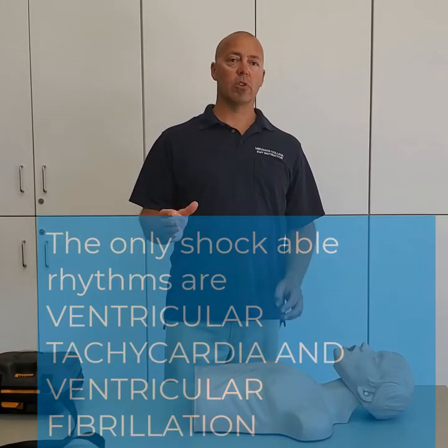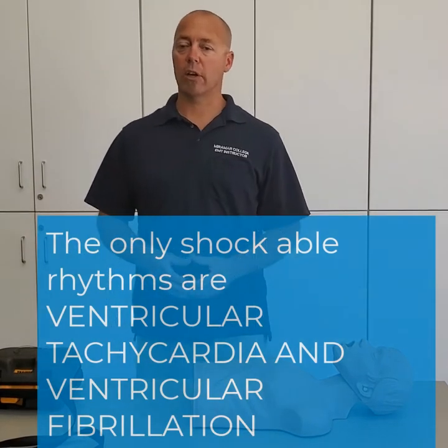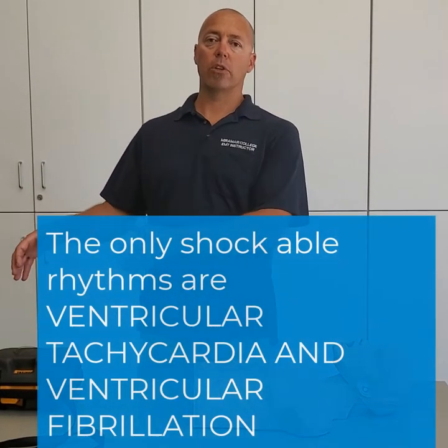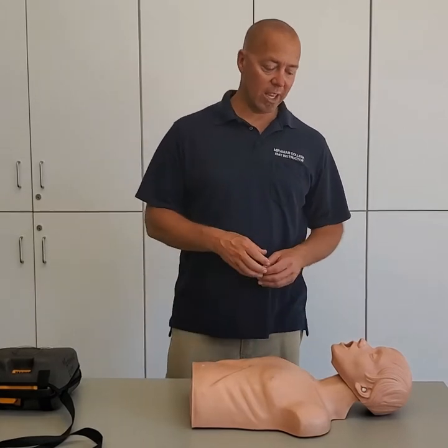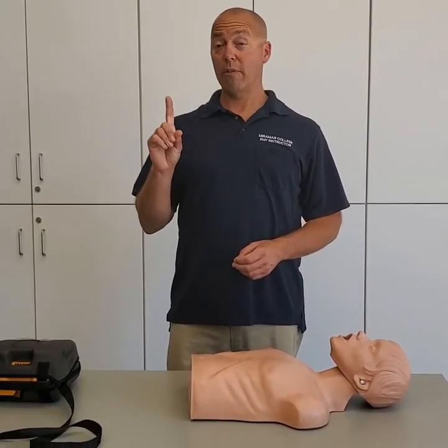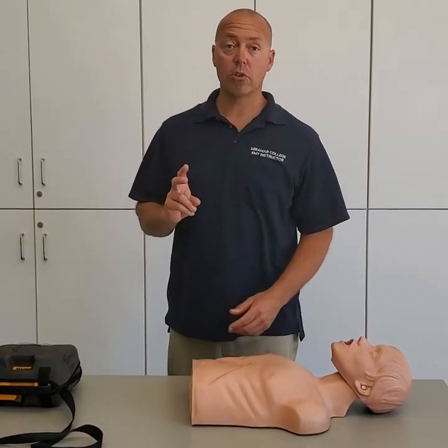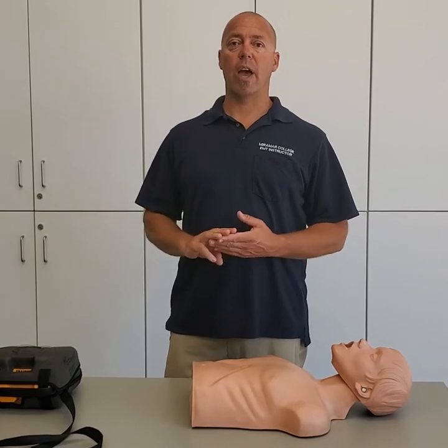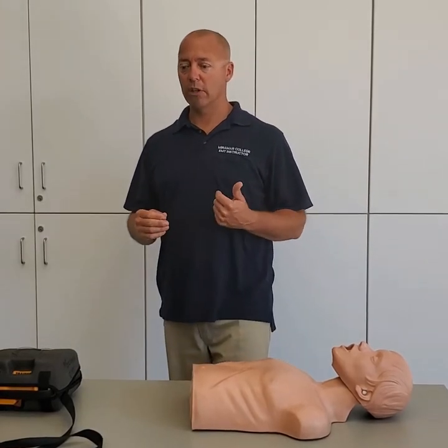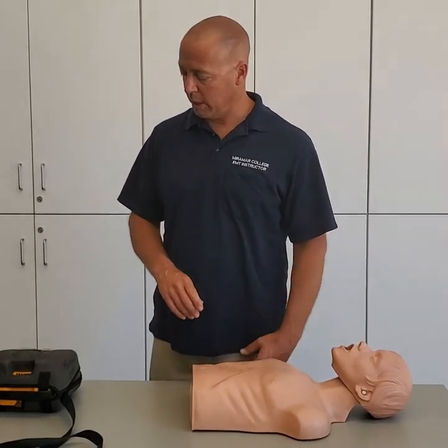The two rhythms that we're going to shock are ventricular fibrillation and ventricular tachycardia. In order to use the AED, my patient has to be: first, unresponsive; second, pulseless; and third, apneic — not breathing. So unconscious, no pulse, and no breathing are the criteria for using the AED.